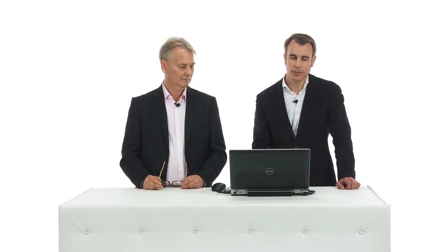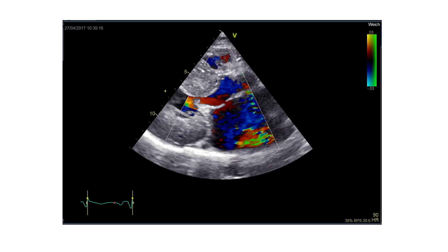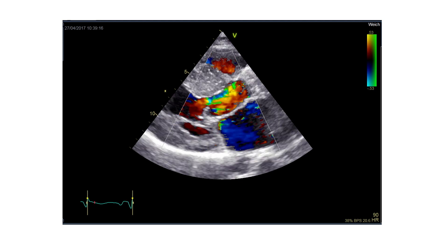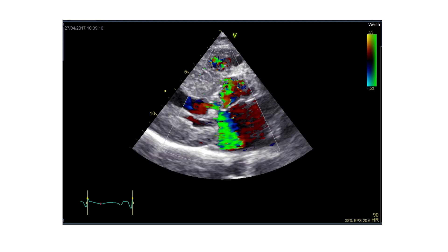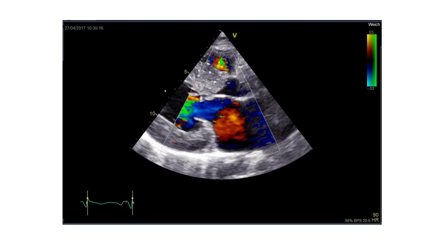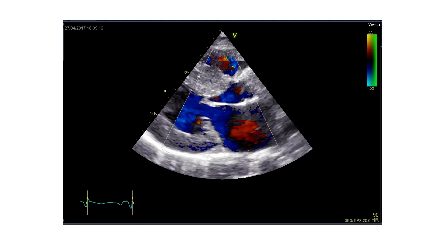Does the patient also have mitral regurgitation then? Yeah, I put on the color Doppler and you can see that he has an eccentric relevant mitral regurgitation, and you can also see the turbulent flow in the left ventricular outflow tract. So two reasons why this young man has shortness of breath.